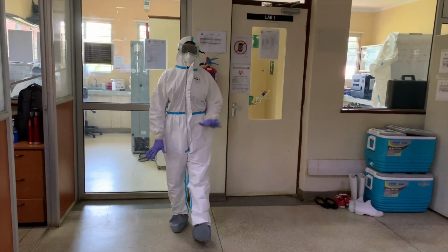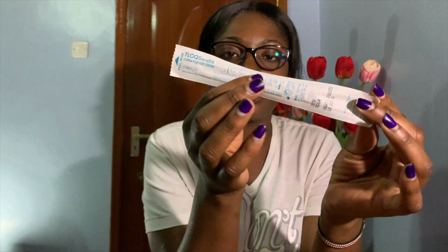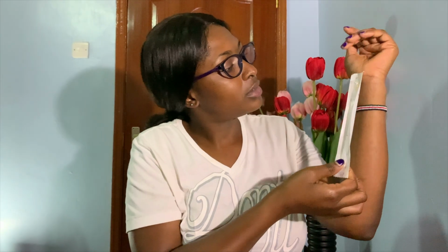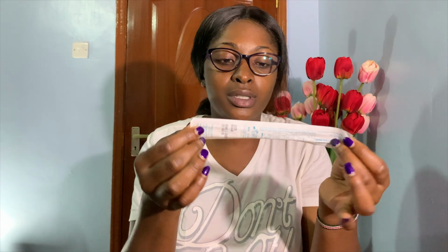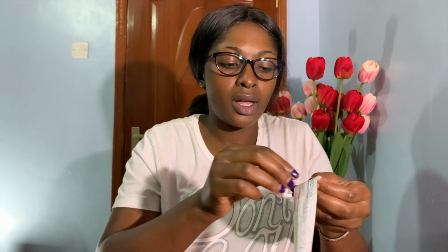And this is the swab. It's that long. Of course, it is sealed. It's not contaminated or anything. So it has instructions on how you open it. I'm just going to open this. This is how the swab looks.